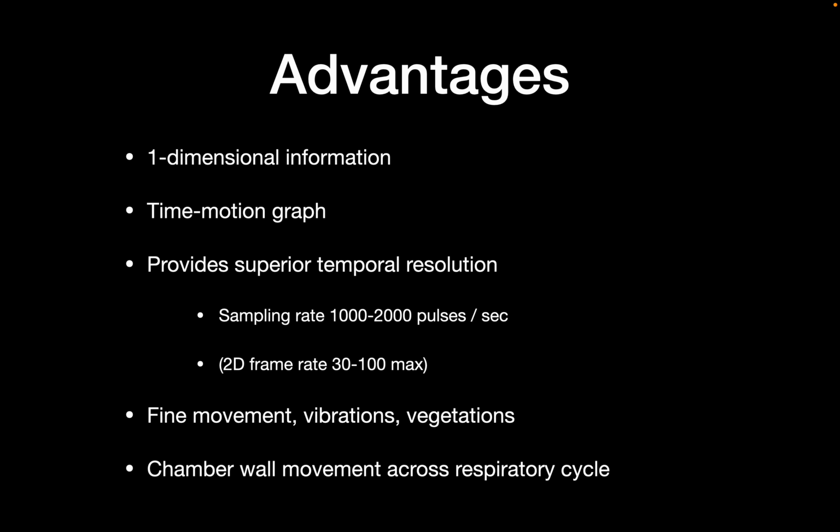If you reduce the sweep speed, you can check for chamber wall movement across the respiratory cycle. As I mentioned earlier, for example, this is a good way to check for chamber collapse if you're suspecting cardiac tamponade.